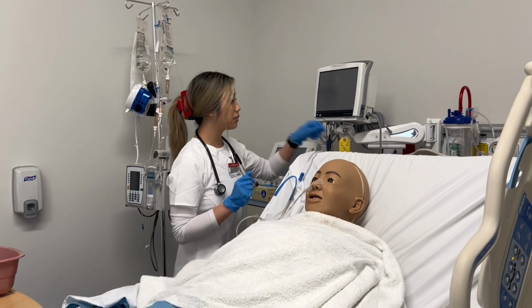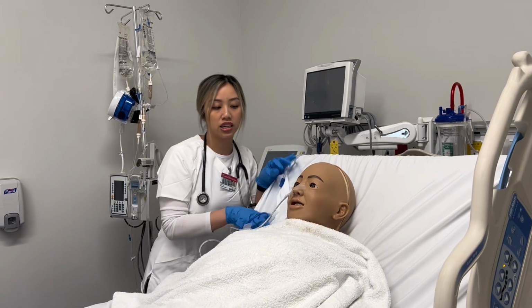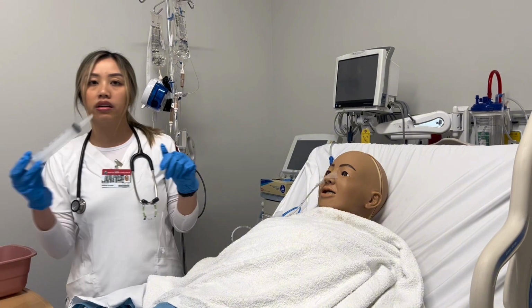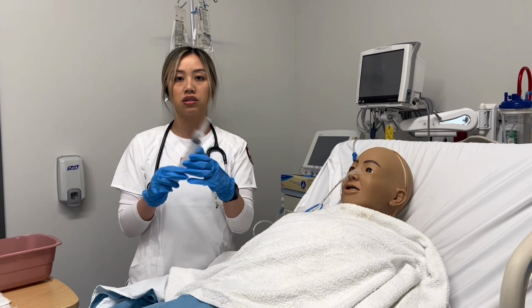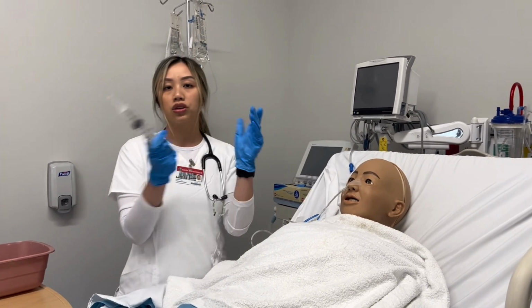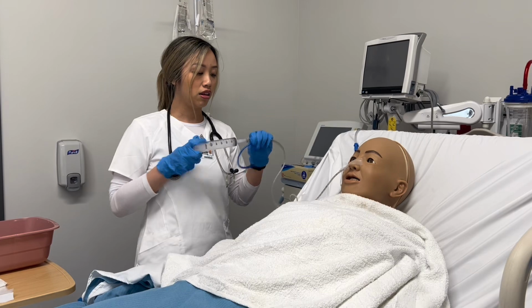So I'm going to switch my suction off. I'm going to go ahead and remove this here. And then at this time, I'm also going to be flushing my tube. It's going to be 30 to 50 mils of air or 10 mils of flush. So we'll go ahead and just do air. So we'll do 30 mils of air. And then we're going to go ahead and flush it. Okay.